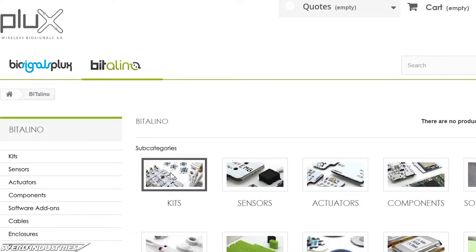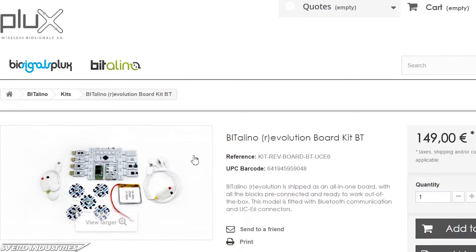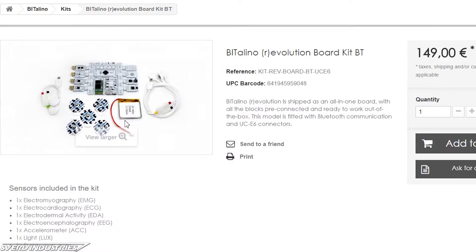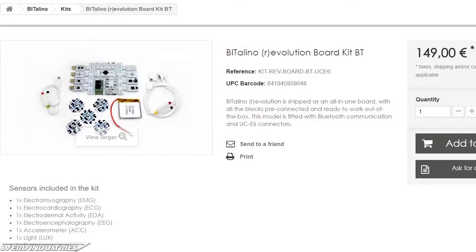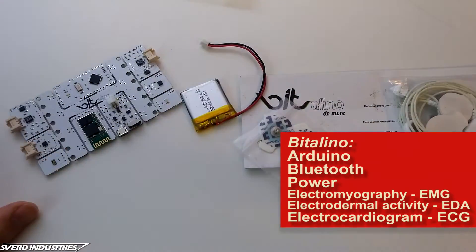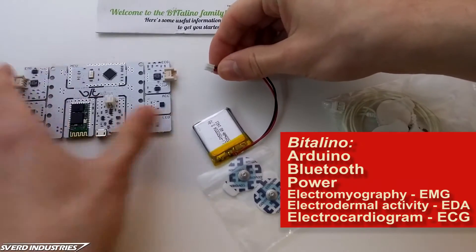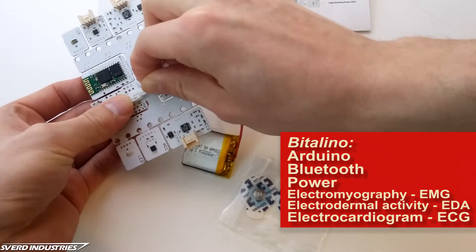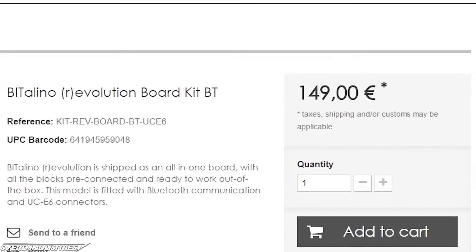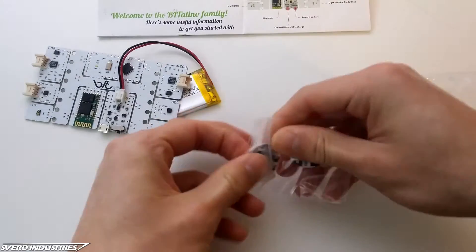The heart of this project is BITalino. This is a sensor kit that actually comes with all the electronics you need to make this project. You get an Arduino, bluetooth module, battery charger, and sensors for measuring electromyography, muscle activity, electrodermal activity, skin conductivity, and electrocardiogram or heartbeats, along with pre-gelled electrodes. This is what we're interested in. The kit is kind of expensive, so make sure you either really like the gift recipient, or you really want to experiment with these sensors.